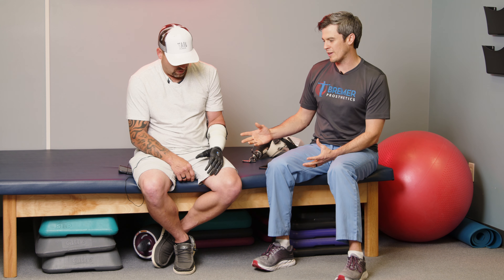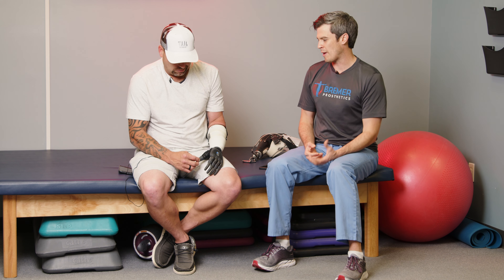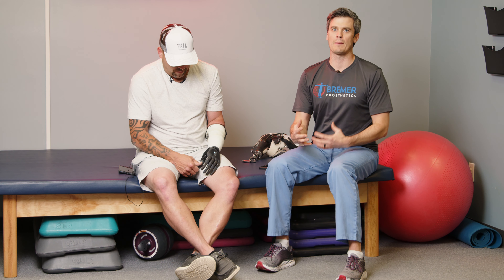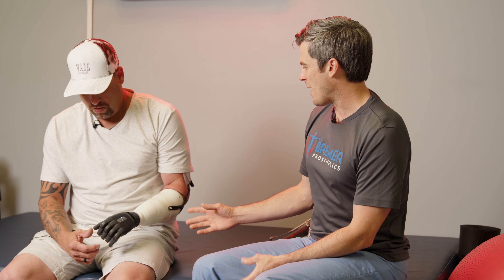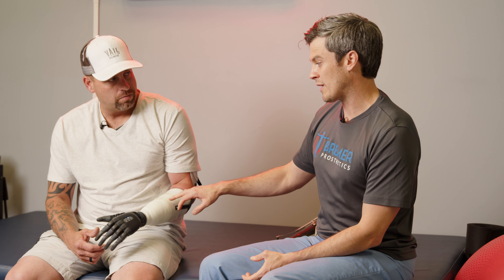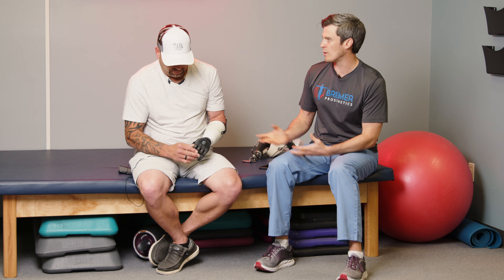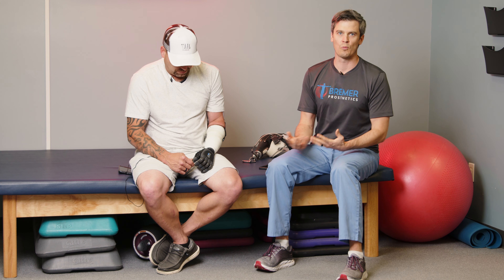There are more complicated control strategies for it. Some people have difficulty operating this, or they want to switch modes intuitively — constantly going from picking up something flat to picking up something circular, and it's a pain in the neck to switch modes. There are ways we can program the hands to do things like that. Instead of two sensors, there are systems out there that have up to 17 sensors on the arm so they can really pick up the differences in the grip patterns of what he's trying to do. But this is a pretty good starting point for somebody that hasn't done it regularly.